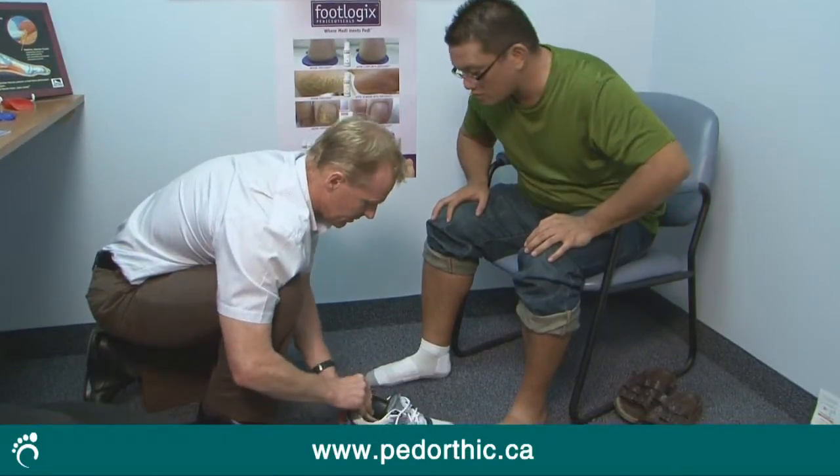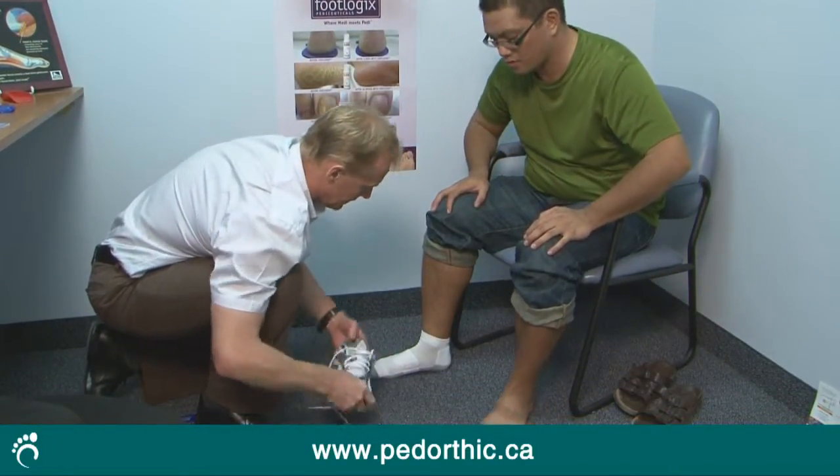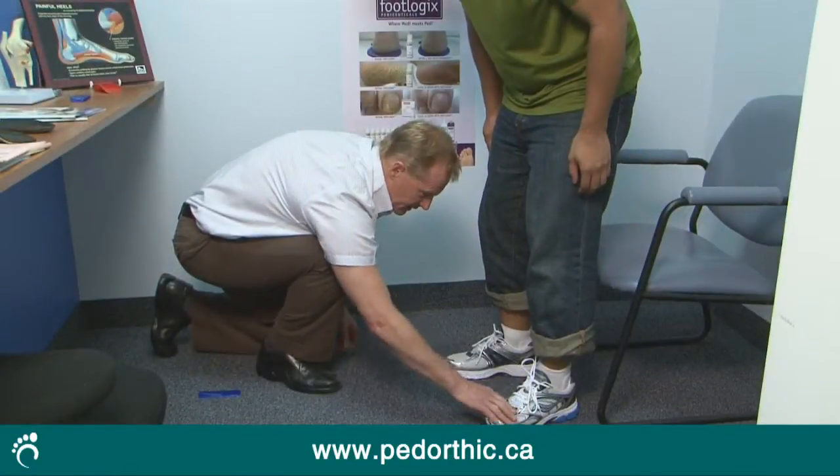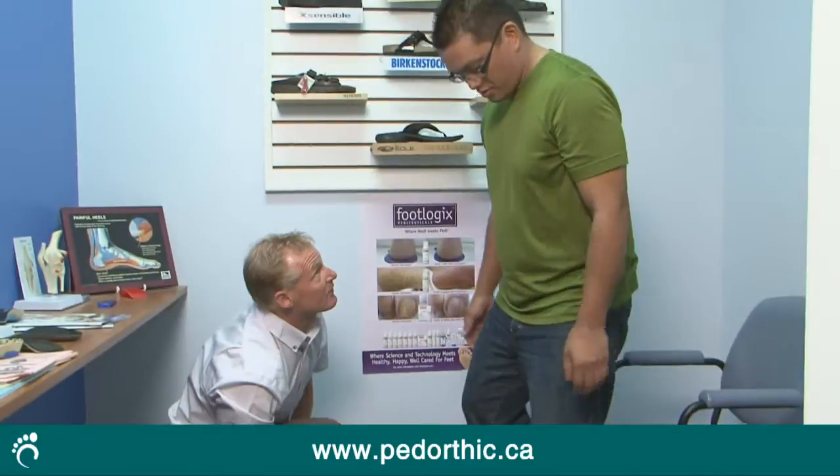Once the orthotic is fabricated, the pedorthist will have the patient in for a fitting appointment. At this time, it will be ensured that the orthotic fits the patient's shoes and any fine-tuning adjustments will be done to ensure that it is comfortable.